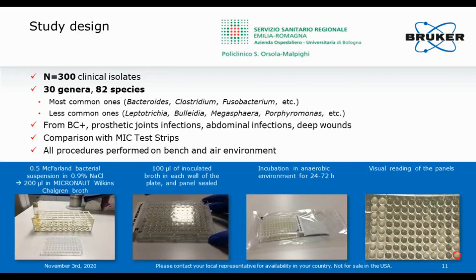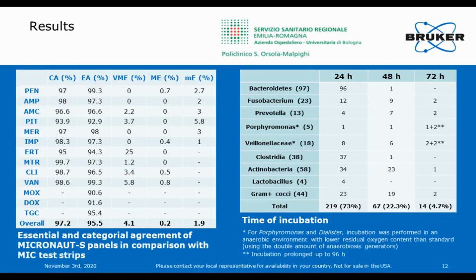MIC strips test was performed following manufacturer's instructions, using the same antibiotic molecules, a 1 McFarland suspensions and Brucella blood agar. And here I summarize the results of the study.